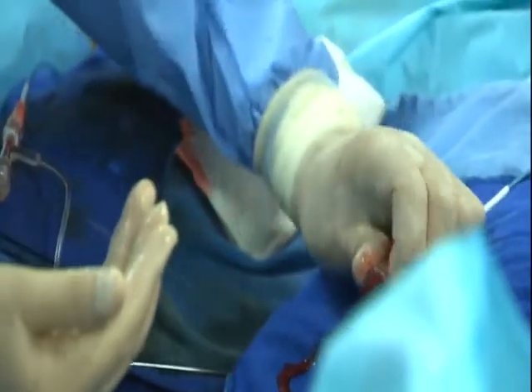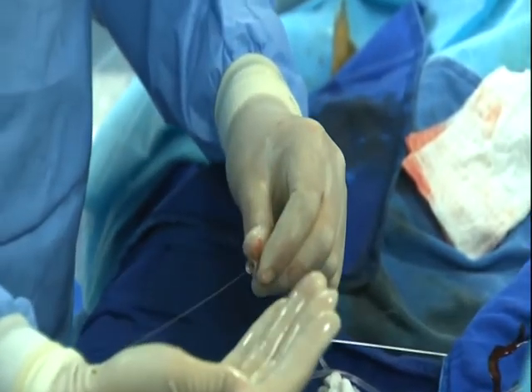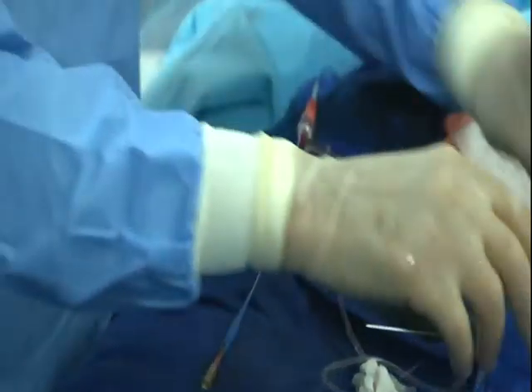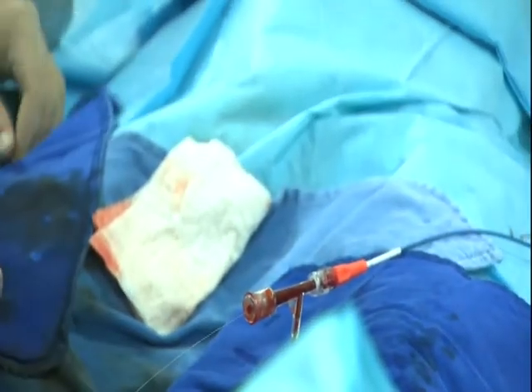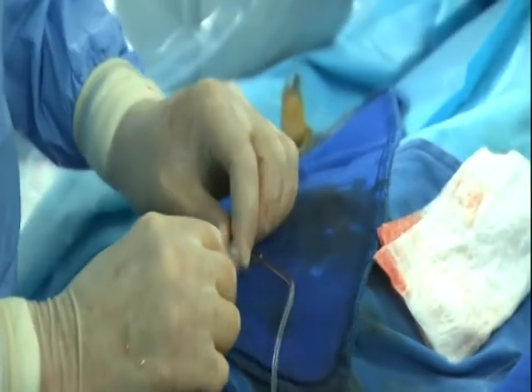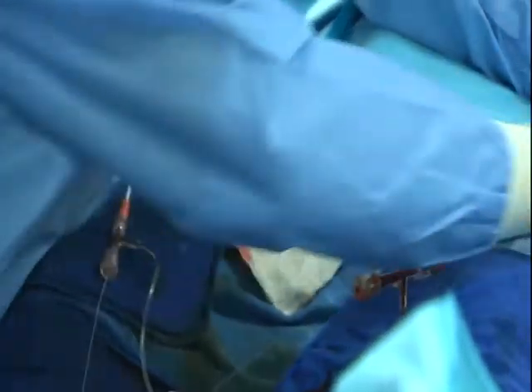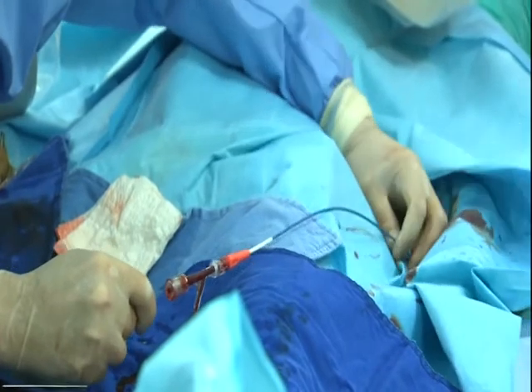You see, on both I have two wires. It's a looped wire now, so I have to insert my retrograde wire to the RCA. Now I have to insert my guiding into the right.